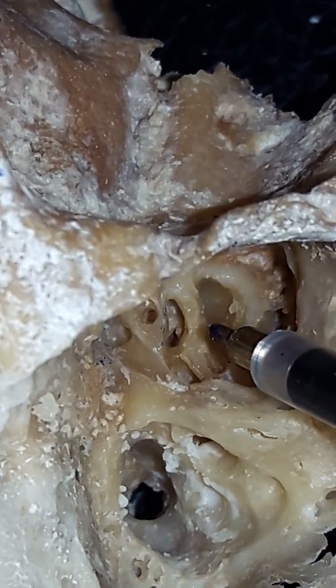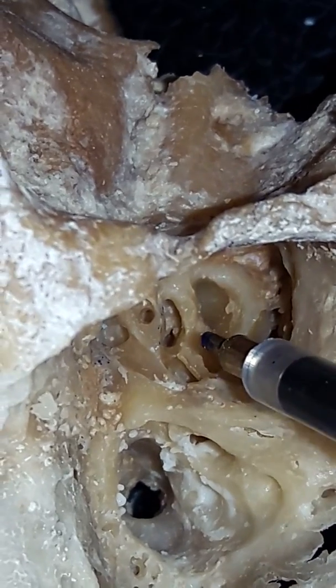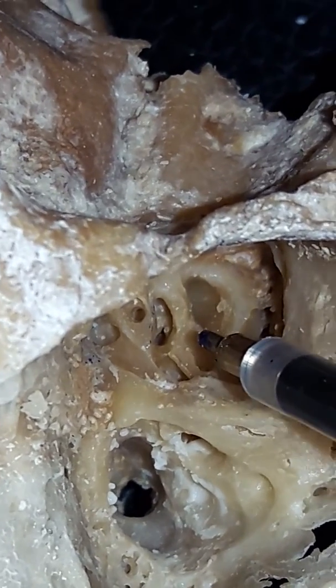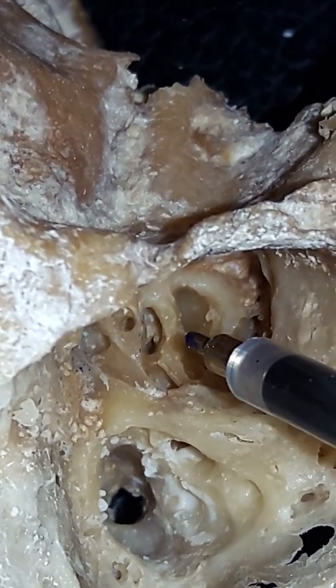When you are drilling the superior lip, the posterior superior lip, you have to be very careful, as the posterior superior part of the round window membrane is very near to that.